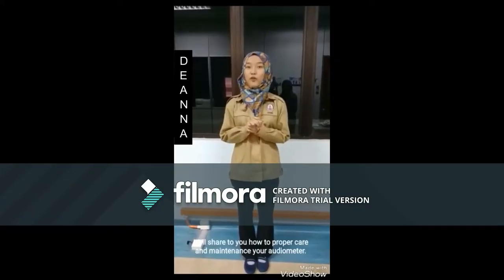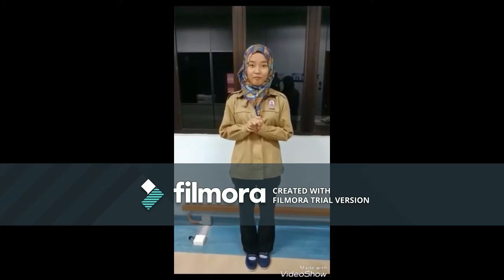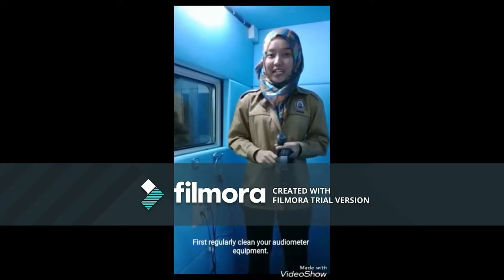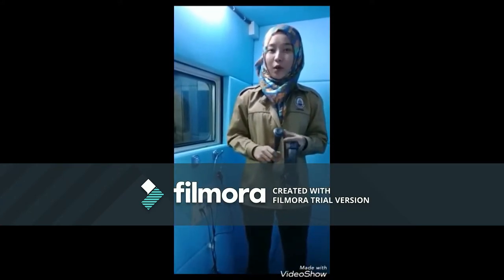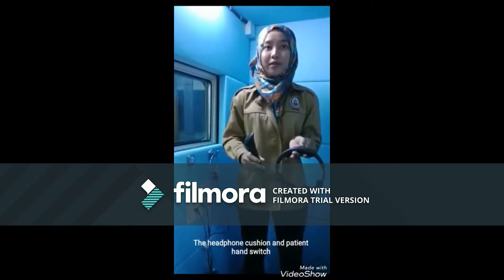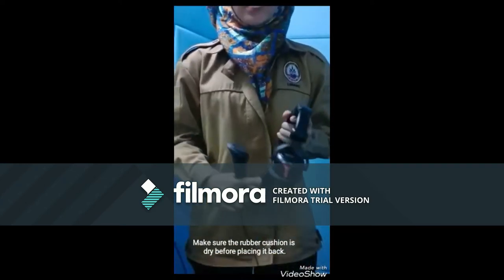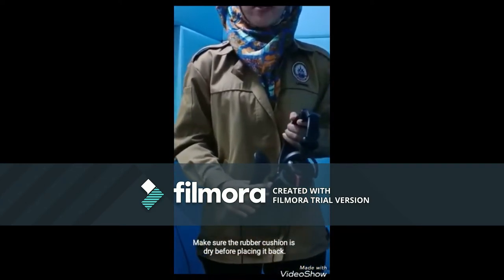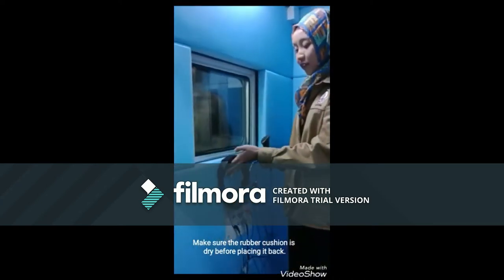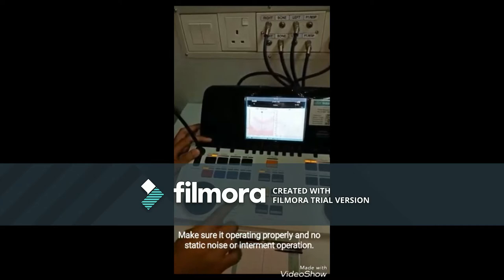I will share with you how to properly care for and maintain your audiometer. First, regularly clean your audiometer equipment. The earphone cushions and patient hands should be cleaned after each patient procedure. Make sure the rubber cushions are dry before placing them back on the transducer. Make sure it's operating properly with no static or intermittent operation.